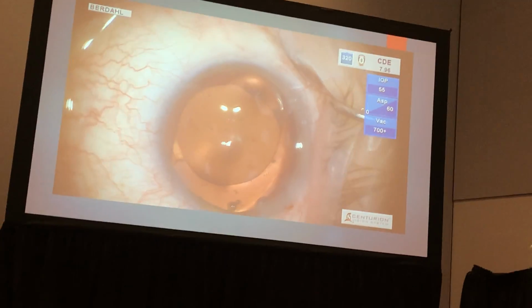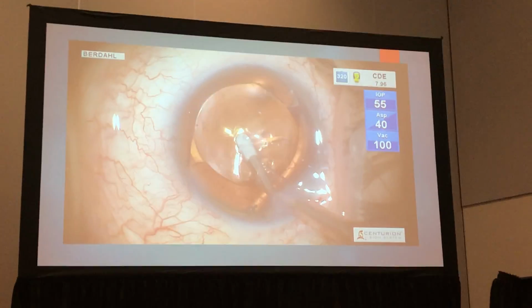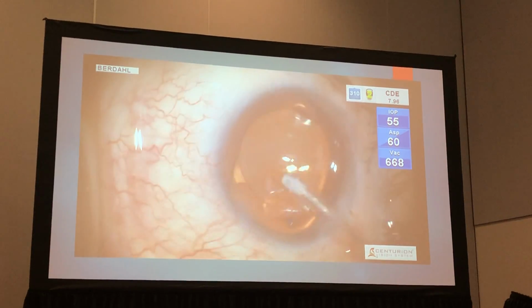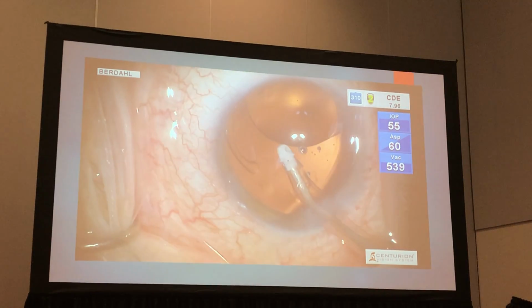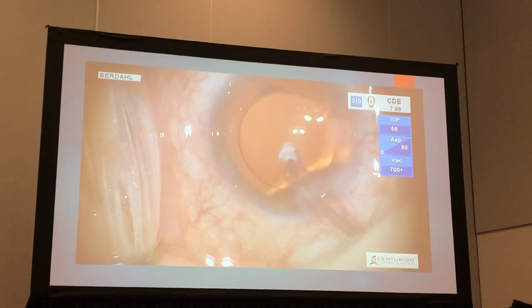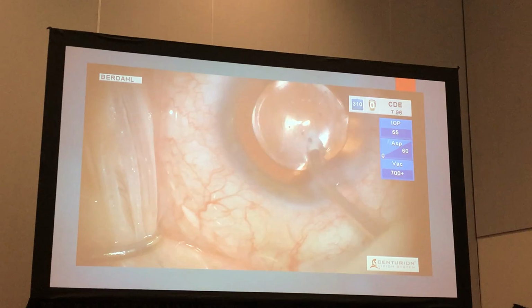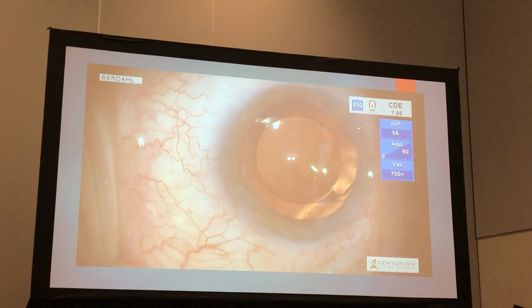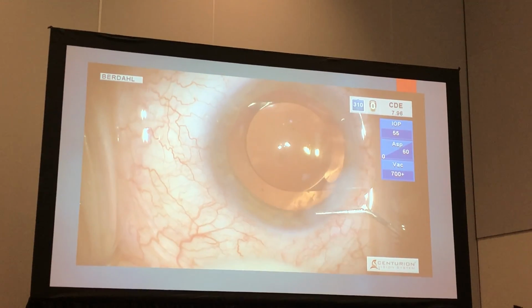I do think it's important on these multifocal IOLs to have them be well centered. So you'll see that pay attention to the corneal light reflex. The other thing I want to mention is you want to make sure you don't have any viscoelastic or gel on the cornea when you're doing an intraoperative aberrometry measurement. You can tell that he was a high myope before his PRK, even without knowing his historical records, just because there's so much room in this eye. Looking right there, I want to make sure that those Purkinje images are well centered and they look just great. If the patient looks directly at the microscope, make sure the centration stays where we want it to be in this large eye.